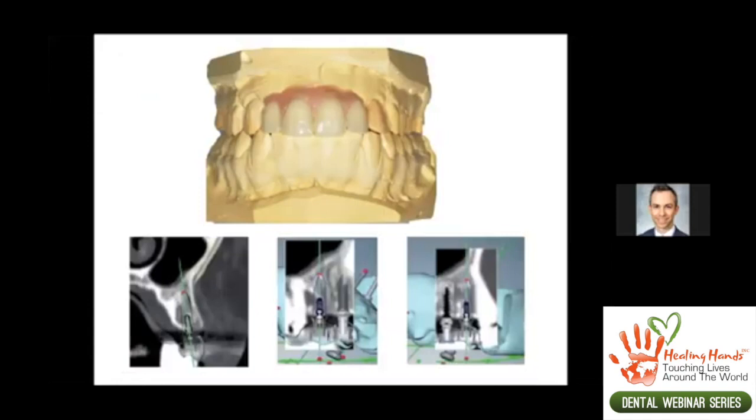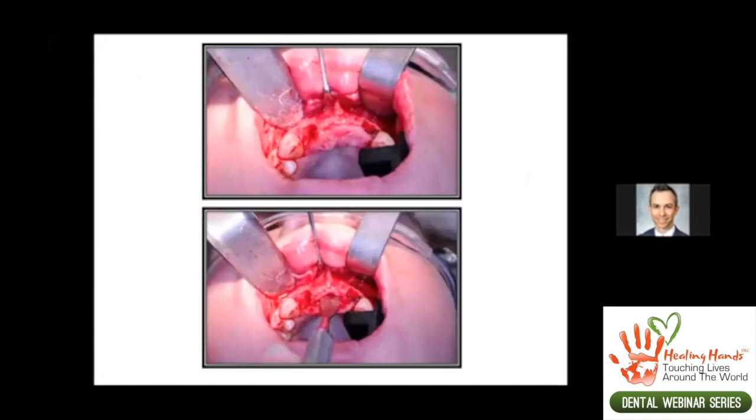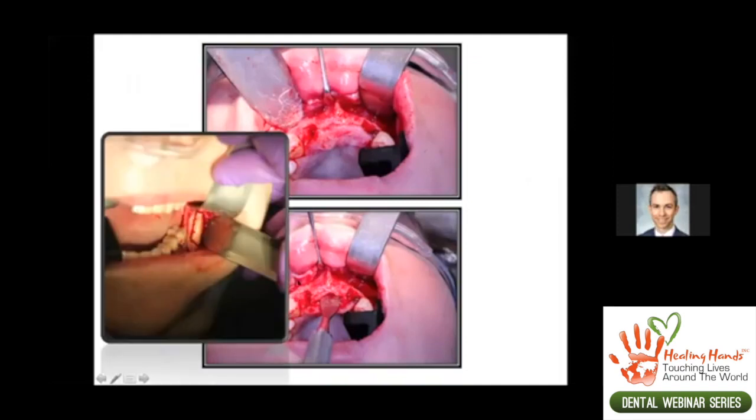What we did is we basically went ahead and exposed. This was part of a study, so she was part of the treatment group that had to obtain autogenous bone graft. We extracted the lateral incisors and basically performed a socket preservation graft in those areas. And this is my approach to a ramus graft, an incision along the ramus and in the third molar area.